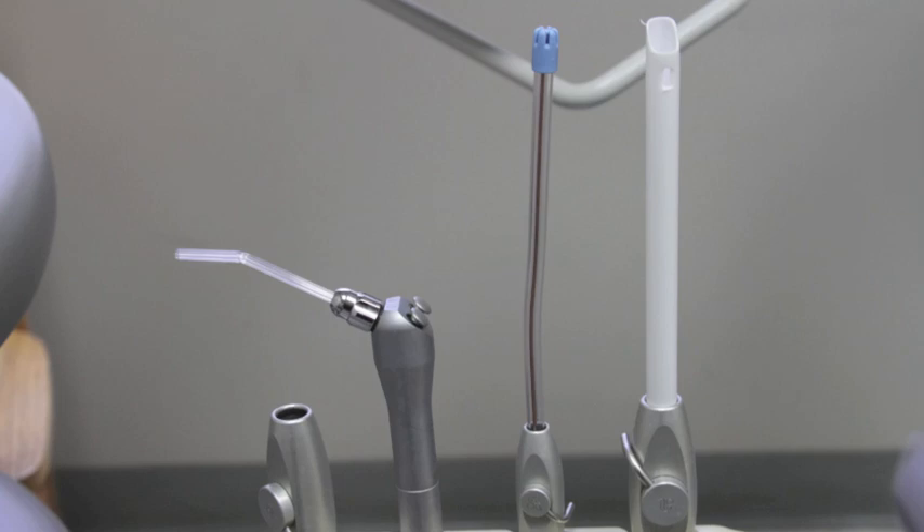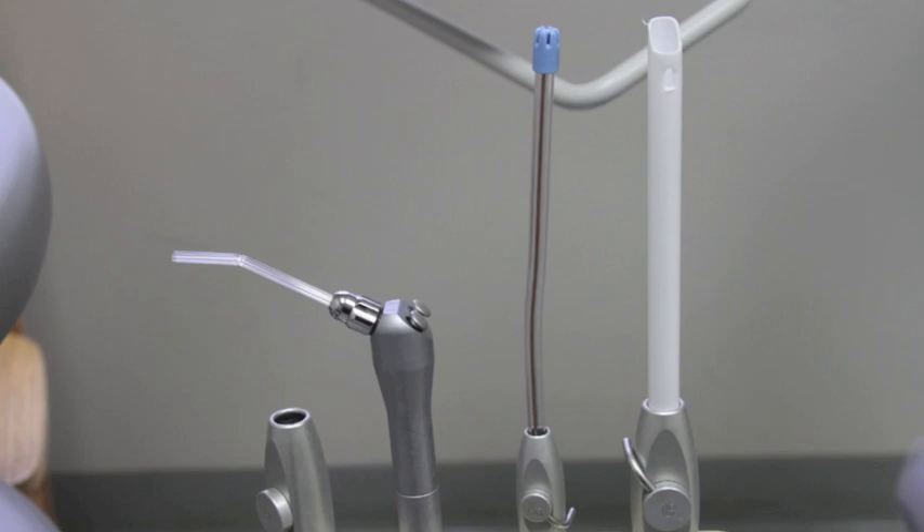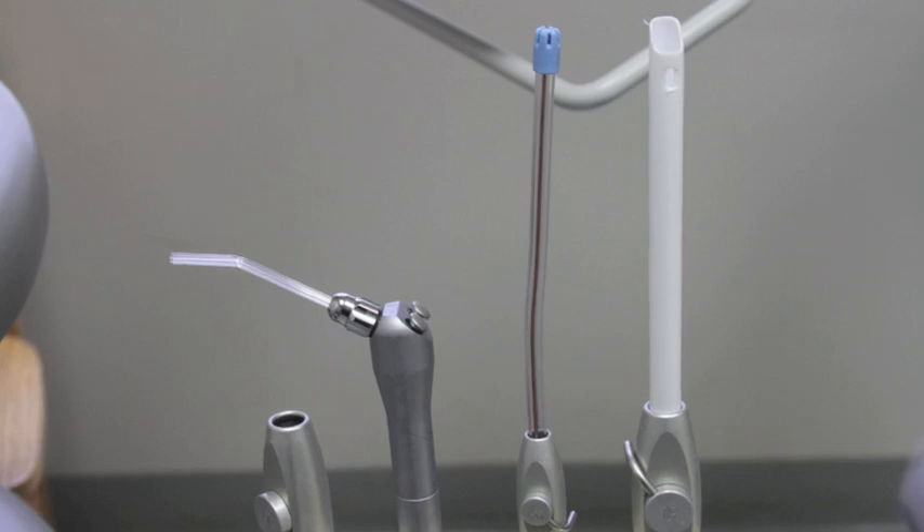We have two instruments for evacuation: the saliva ejector and the HVE, also called the high volume evacuation. Both are used to remove water from the oral cavity. If there are large particles to remove, we're going to be using the HVE. When there aren't, we'll be using the saliva ejector. It's important to note that if you are not using the instrument at all, close the valve.